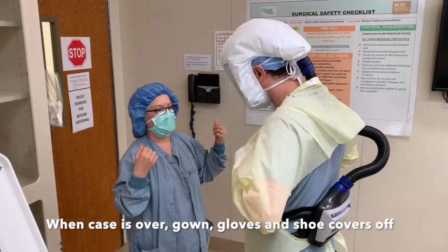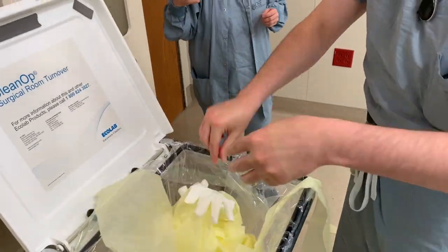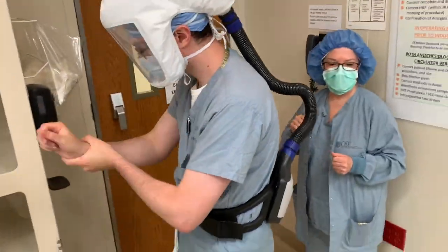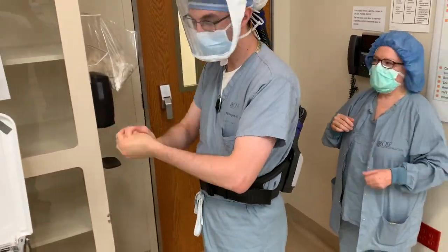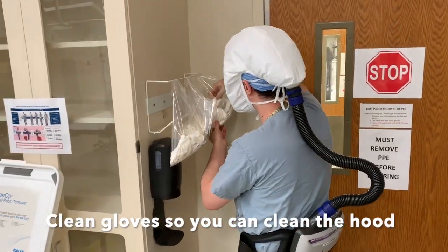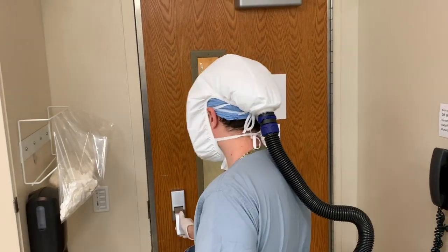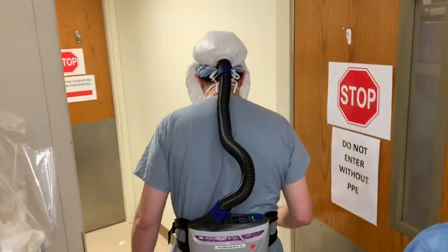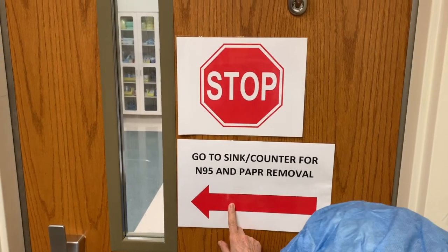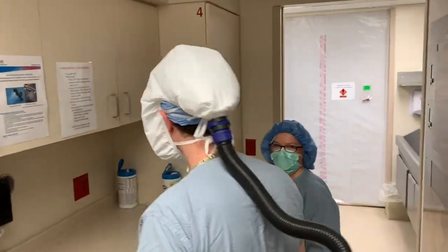When the case is over, after you have talked to anesthesia to make sure that you can leave the room and the patient is safe and stable, you remove your shoe covers, gown, and gloves that you would have on in the OR, gel your hands, and put on a set of gloves so that you can go and clean your PAPR and hood. This is after the patient is stabilized. You do not go into the anteroom — you go over to this clean area counter.